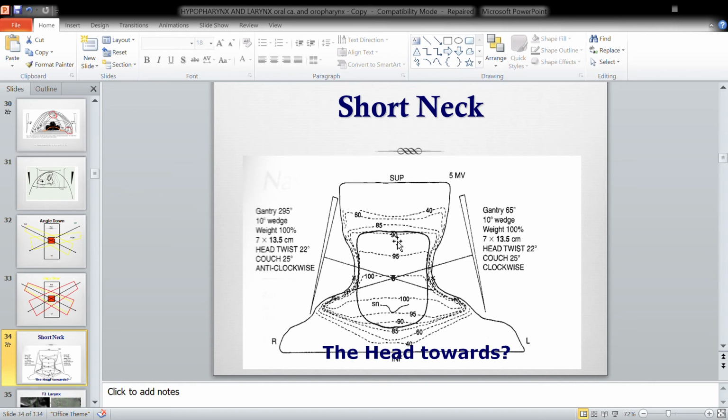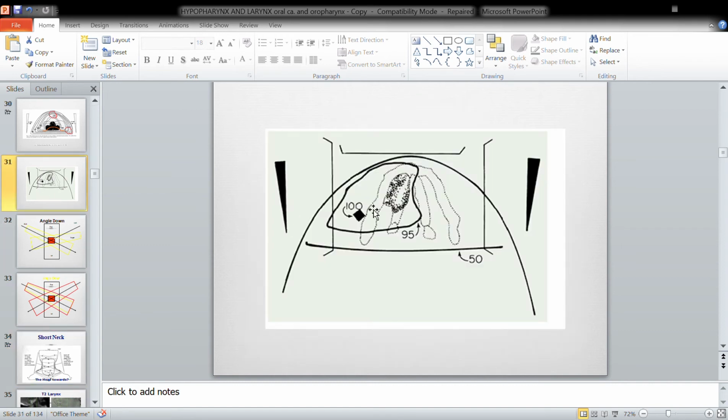So you have to be very careful with that, and this is one of the points that I wanted to stress. I want you to be generous. If you remember, we talked about the three field technique, and also about the 2D, about unequal weight. You can increase the weight from one side and reduce it from the opposite side. So I'm not surprised if you decided to go for T1 glottis, very localized. You don't have to worry about it much because it has been done for a very long time. It's not new, but be careful if the information about your tumor is missing.